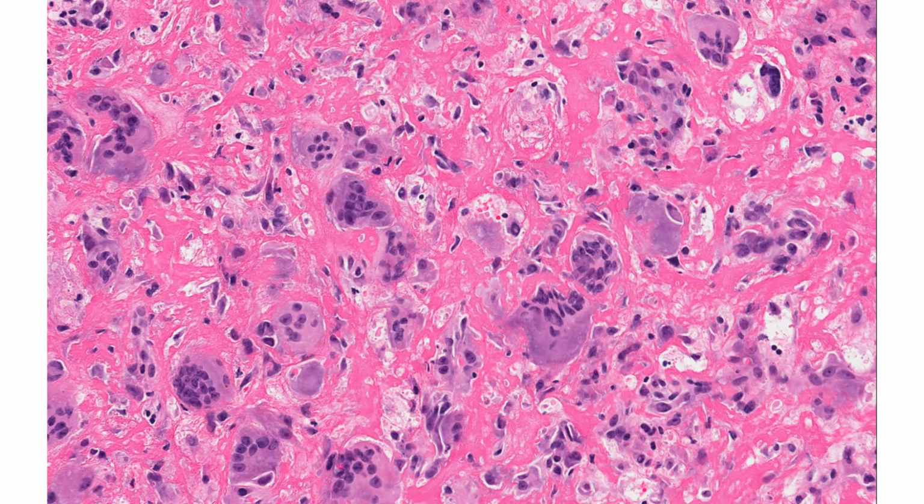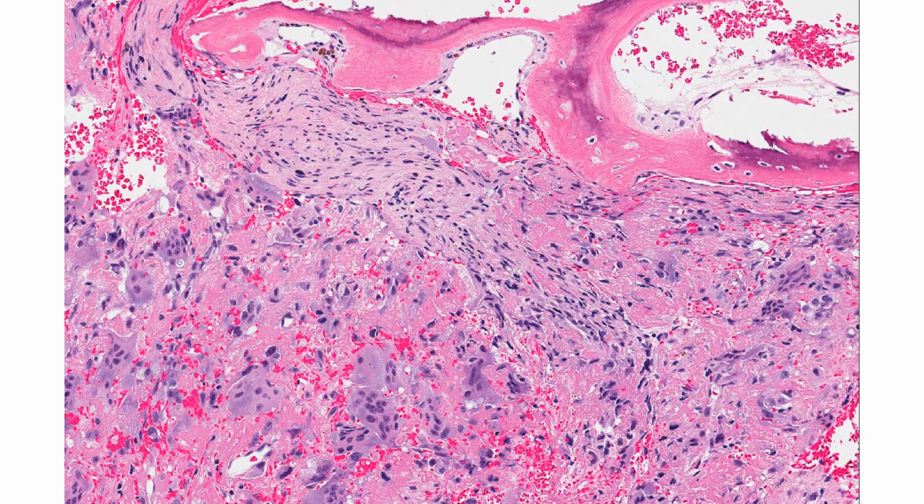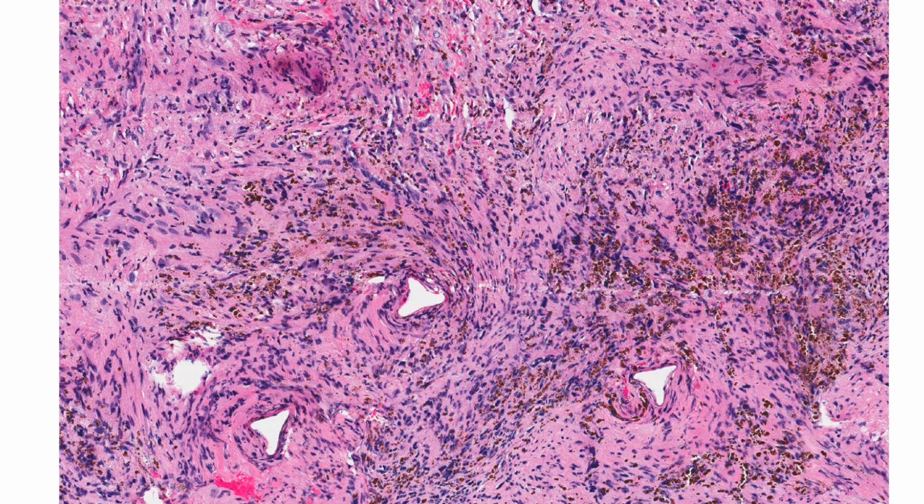This again high power view shows hyalinized stroma with multiple multinucleated osteoclast-like giant cells. This higher power view shows other areas with spindle cell histiocytic cells without atypia, bone with osteoblastic rimming, and osteoclast-like giant cells. And another higher power view shows areas of histiocytic spindle cells with no atypia and brown hemosiderin deposition. The tumor was named brown tumor due to, in some cases, abundant hemosiderin deposition and brown color grossly.